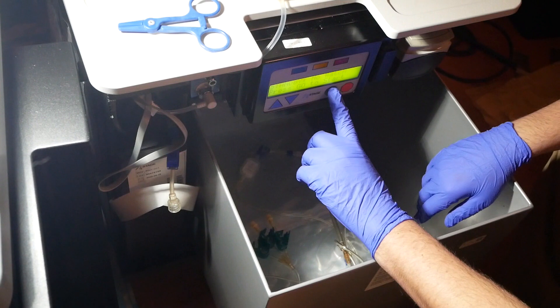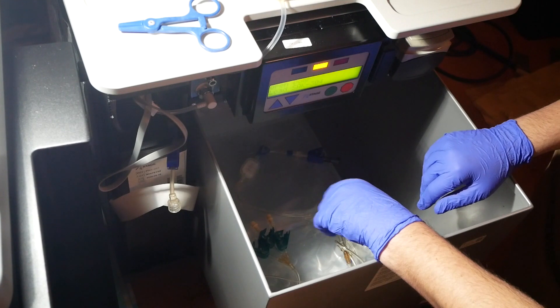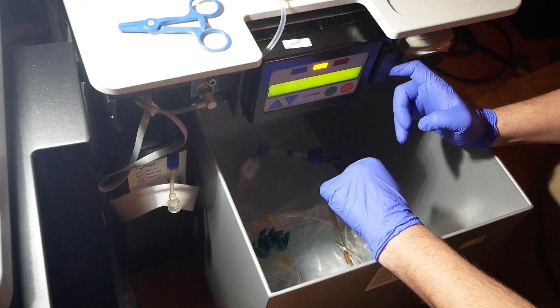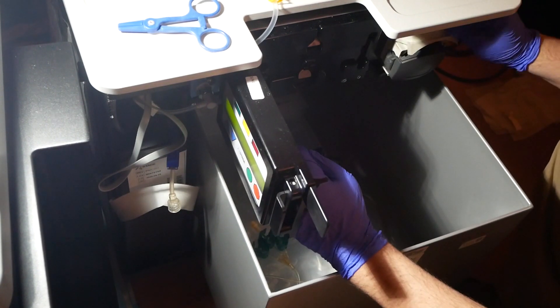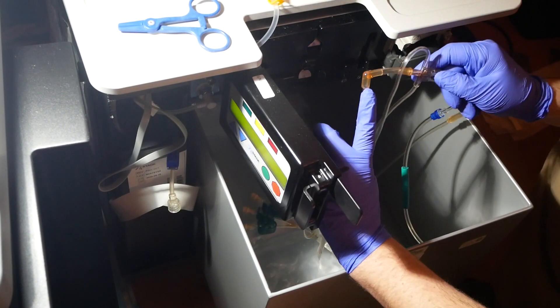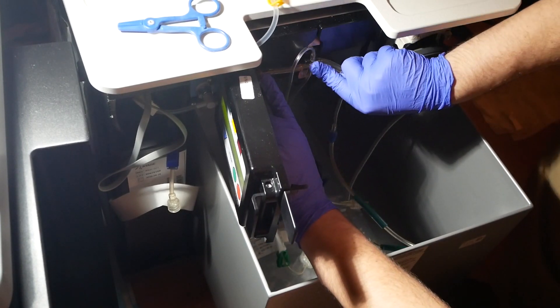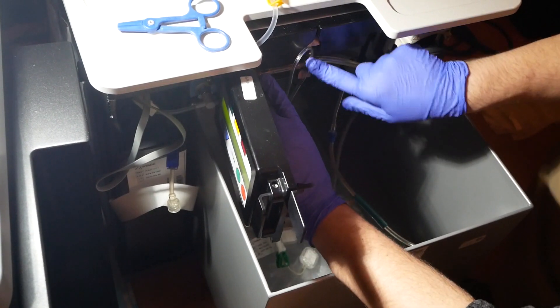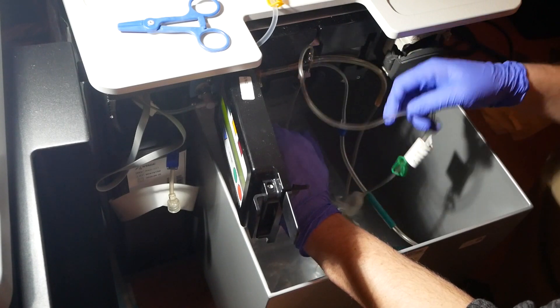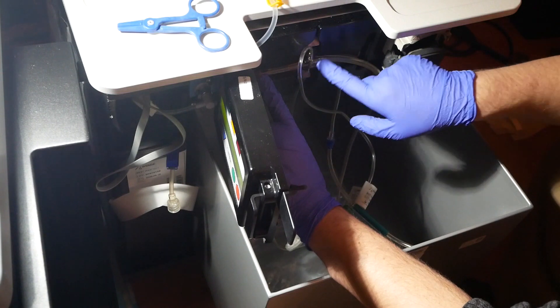Now we're ready - I hit go to start. It says 'initializing' for a second, then says 'open door, load sack 304.' I open my door and this little door here too. You take the elbow end and that goes right in this spot - there are two little clamps that hold it in place, with the elbow going on the left.